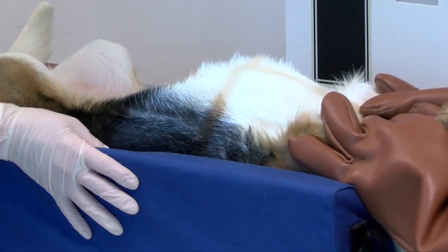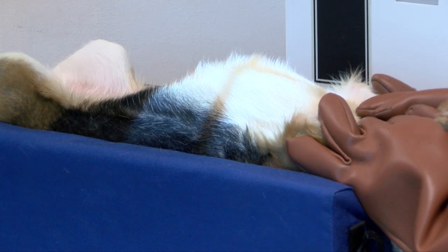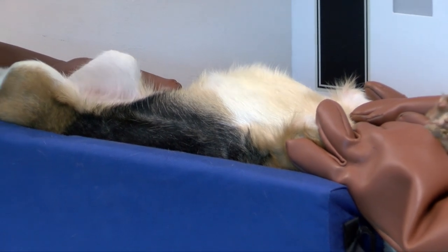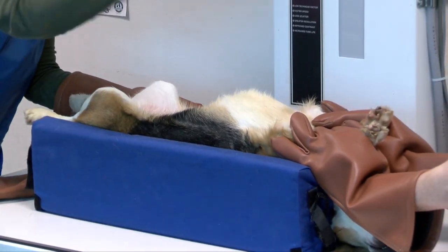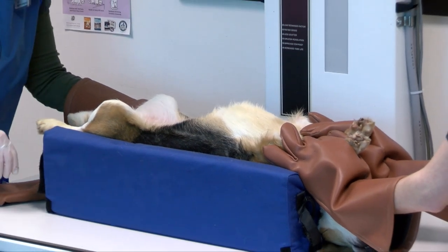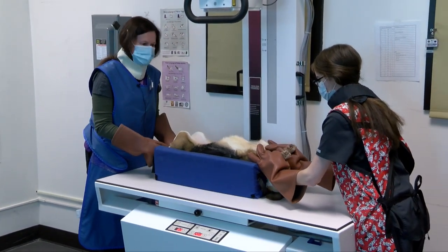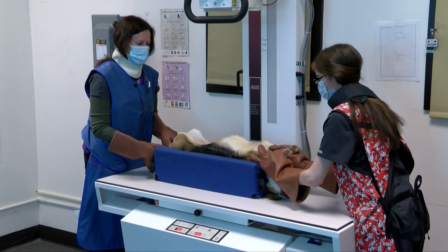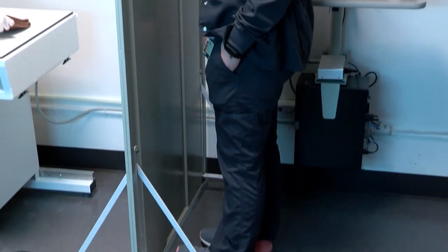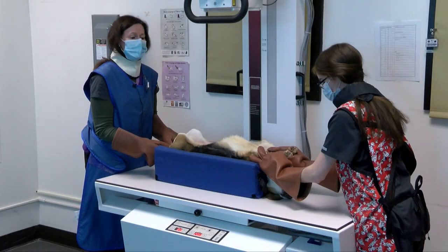Now we're going to show you how we make an exposure. We need to make sure the patient is under the machine and we can light her up and move her around. We open the collimation, which makes sure we're not exposing too much of her or too much of ourselves. We're going to do her thorax. We have to make sure to put our markers on here so we know what side of the animal is up and down — this is on her right side and we're doing a ventral dorsal, meaning it goes through her tummy side and comes out the back side. With the patient positioned straight in the trough, our colleague would step on the little pedal which spins up the machine and generates the electrons, and when they depress the pedal all the way it takes the picture.